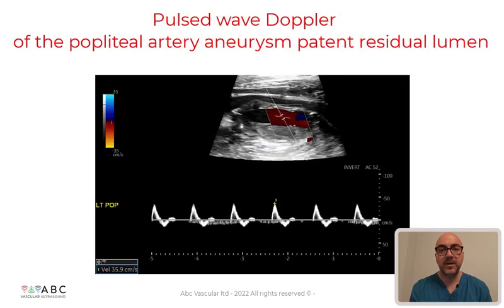To confirm the quality of the flow, we assess the flow with pulse wave Doppler, which demonstrates the presence of a triphasic Doppler waveform.